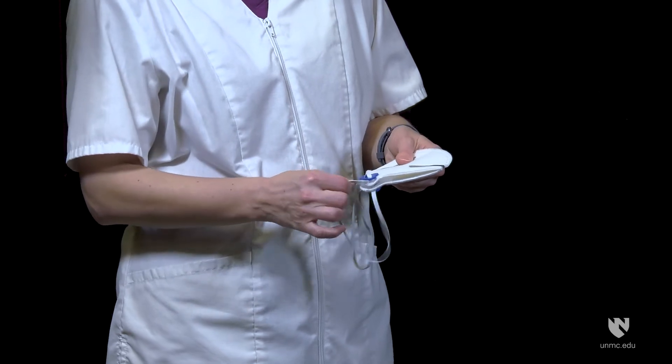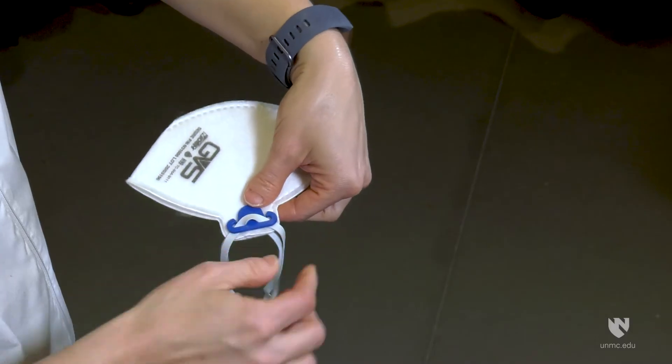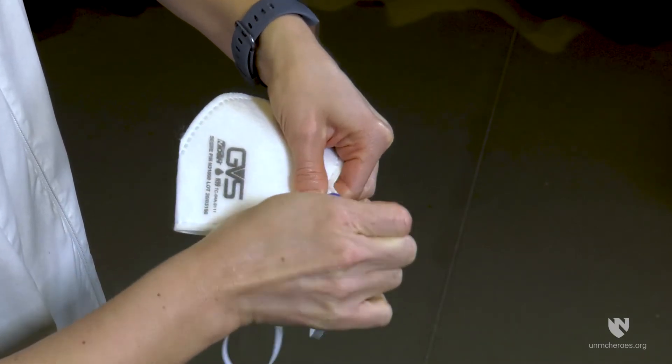Remove the mask from the sealed bag. Check that the lengths of the upper and lower headband straps are equal. If not, adjust them. The length of the strap may need shortening to create a good facial seal. This can be done by winding them around the side clip.